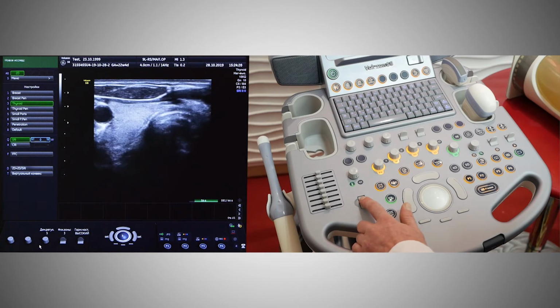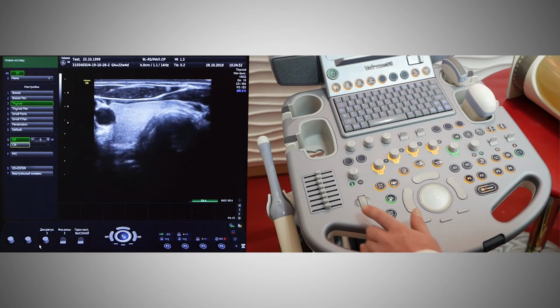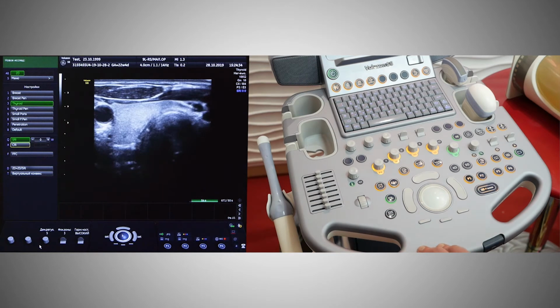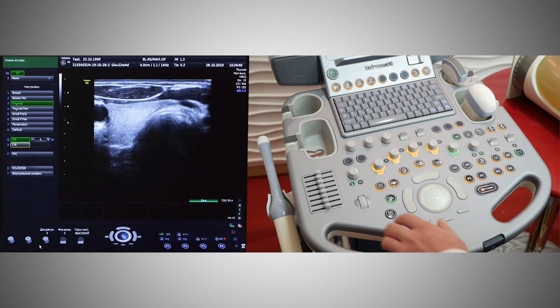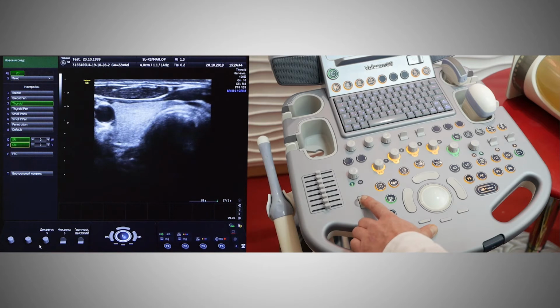What is this function used for? By using it, we can adjust an image for ourselves in such a way that we conduct subsequent examinations without data manipulation. And CRI. Again, we see how the image changes. Turned off. Turned on.